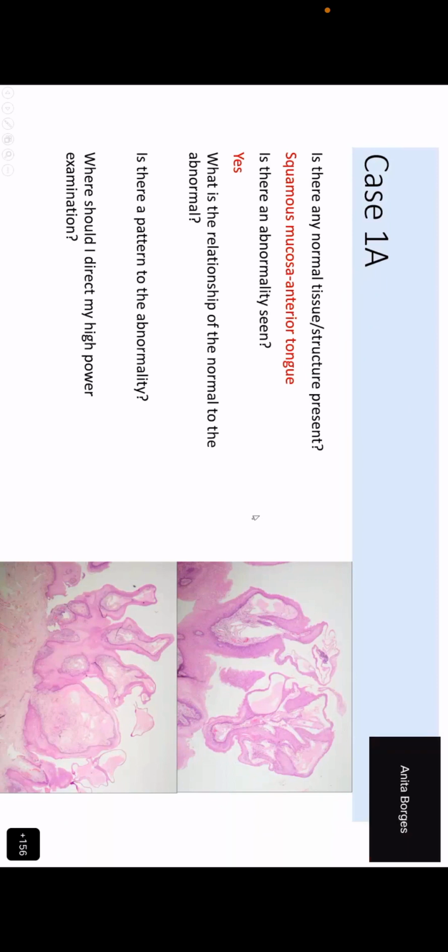Ma'am, some of these cystic spaces are lying intraepidermally. Some are lying intraepidermally and many of them are lying in the stroma, that is in the subepithelium. You can actually see them in the epidermis. Can you point out one over here that is lying in the epidermis? Yes, ma'am, in the epidermis.